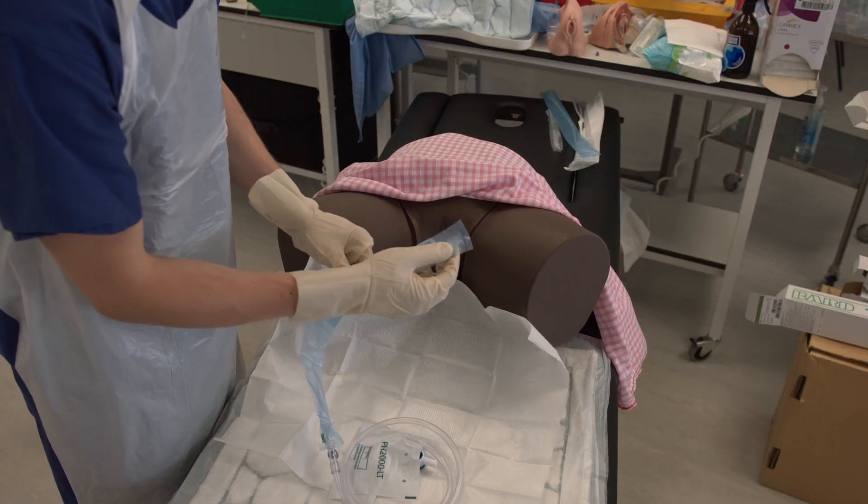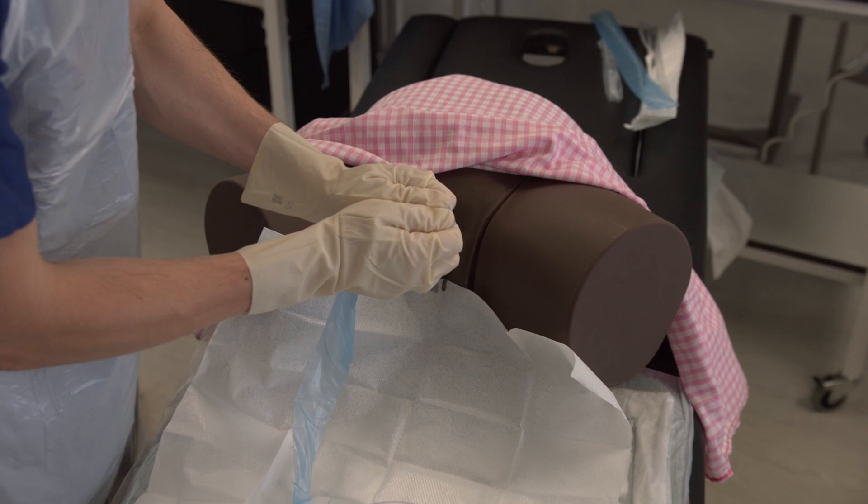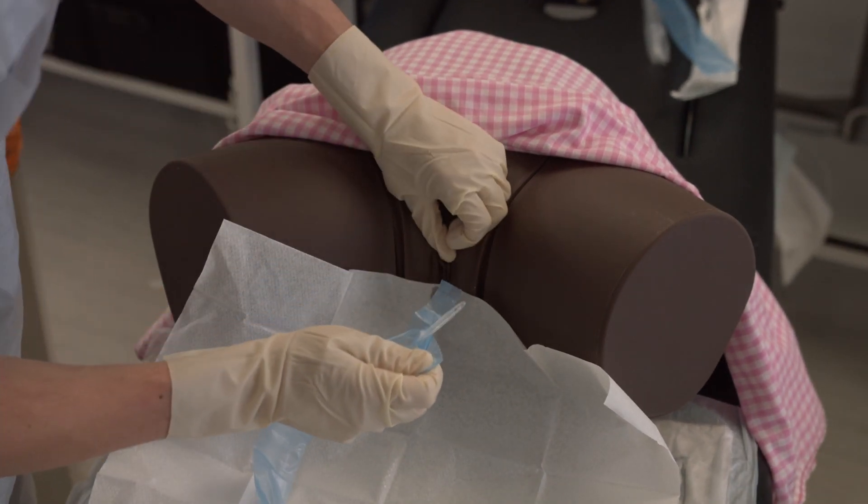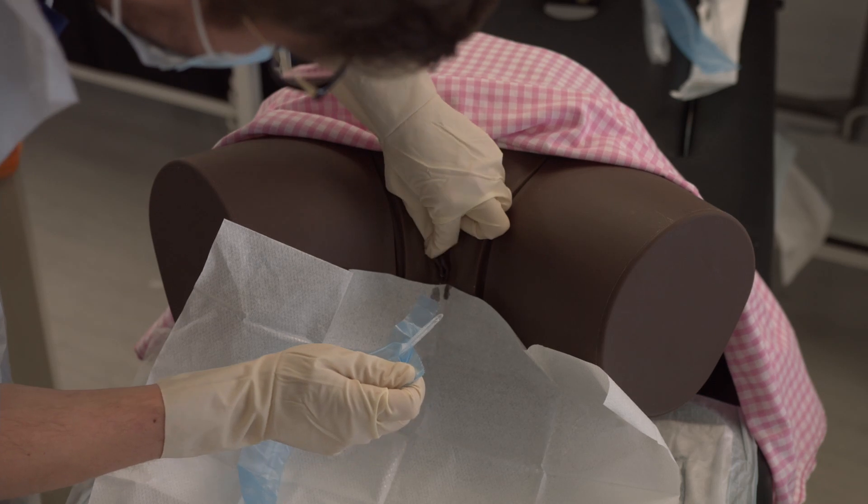Place the catheter bag down onto your protective sheet. Open the front of the perforated bag around the catheter, ensuring you do not touch the catheter itself with your gloves.